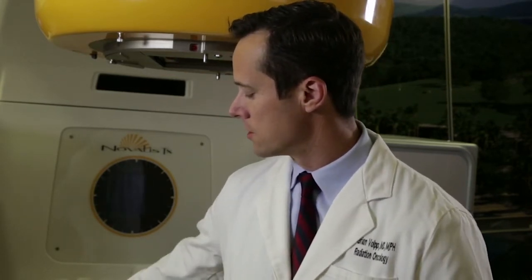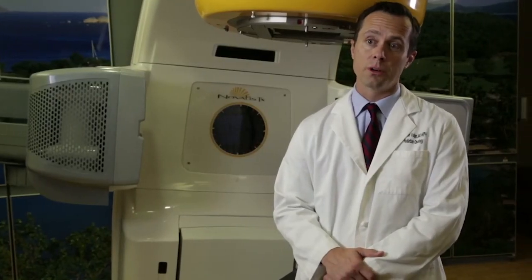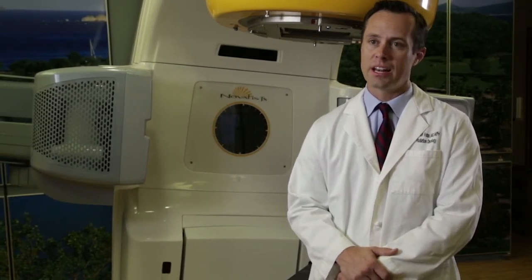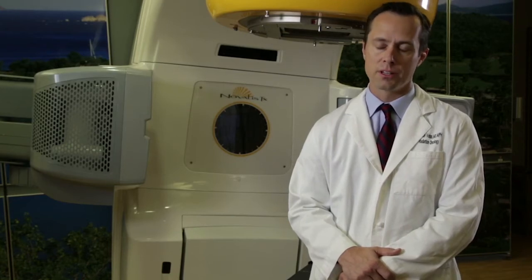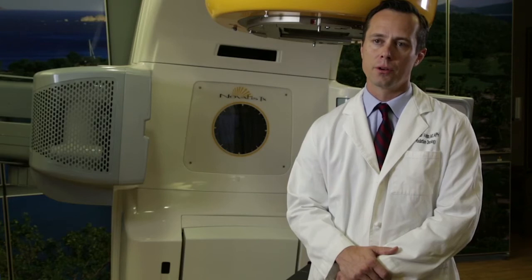It requires a very precise setup, and we have the ability to track where the tumor is using X-rays that are built into the floor of the vault, along with a cone beam CAT scanner that's built into the machine. And so in order to have an accurate, precise treatment, you need to have very good immobilization, very good accuracy, and then a way of developing and delivering a high dose of radiation therapy. We typically have outcomes that are on par with what you would see with a traditional surgery, but it's a much less invasive option. A very good option for patients that are not good candidates for surgery, either because of bleeding risk or anesthesia risk. So it's a very new cutting-edge way for us to treat these tumors that 5 years ago really were out of reach from a radiation standpoint.